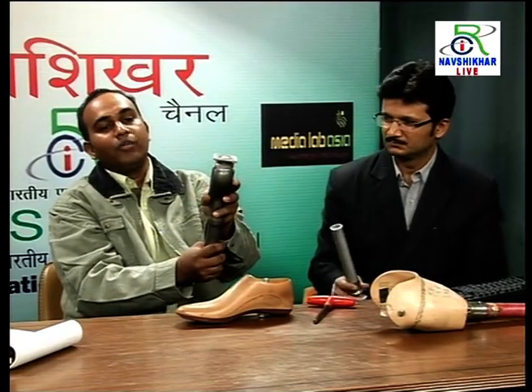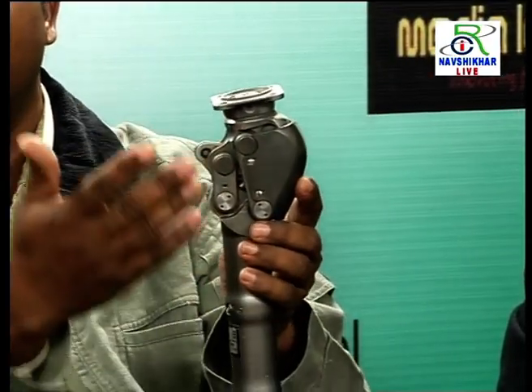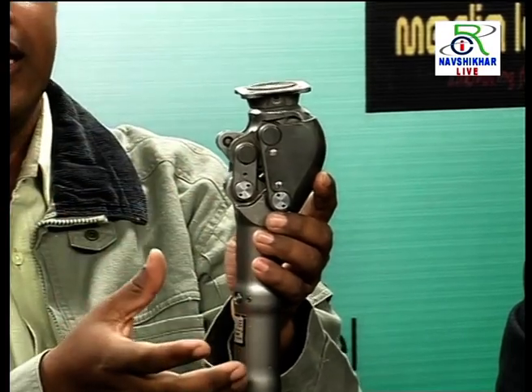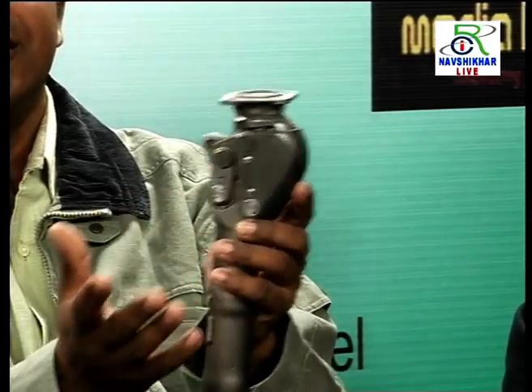In the same way, this is a knee joint. Now this is a 4-bar linkage knee joint, which is spring loaded. If he wants to go for a pneumatic system, which is more advanced, he can do that. If he wants to go for a computerized knee, which is available in the market right now, these can sense your movement and, according to your normal leg, adjust the movement of the artificial limb. If he wants that system, he can go for it, and only the knee joint has to be changed. So this is the big advantage of the prosthetic modular system over the conventional system.